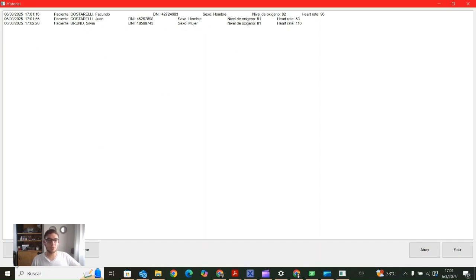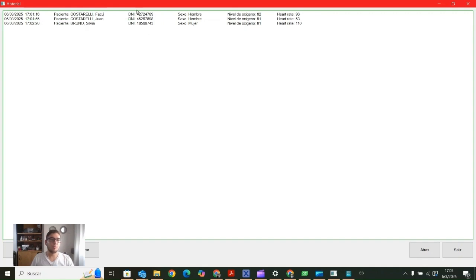What we can do here, we can edit the data, like heart rate. We can, I don't know, change a number because we thought that maybe we made a mistake, or we can change the national identity. Suppose that I made a mistake in the number, or the name. We can change the name, whatever we like, and we can see the date when we took the measurements.